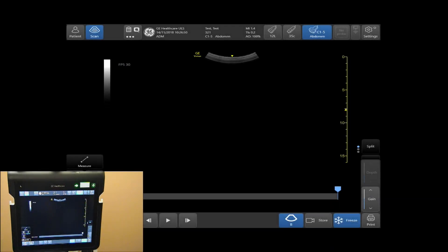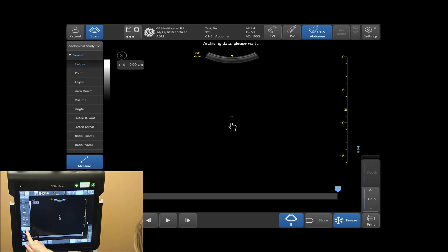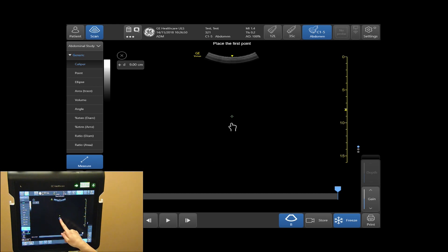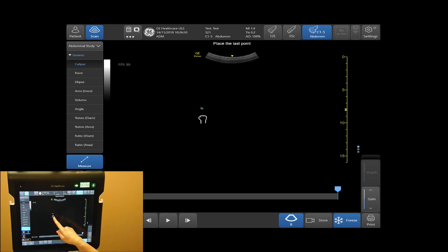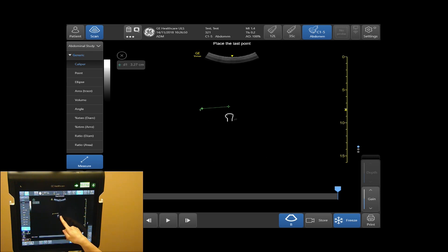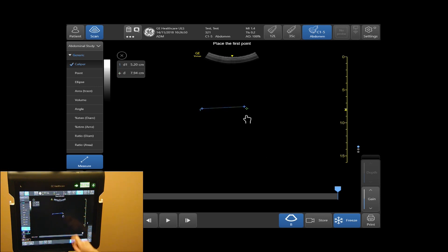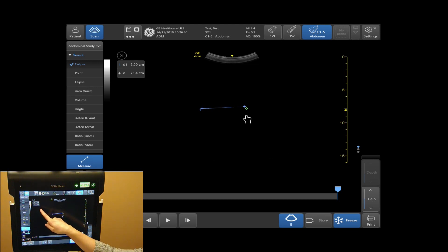To add a measurement, tap the measure tab to initiate your measurements. Tap the hand on the touch screen to move your first point. Tap on the hand symbol to set your first location, then drag your closed hand symbol to its desired location. Tap on the hand symbol to set your second location. Your measurement will then be displayed in the top left-hand corner of your touch screen.